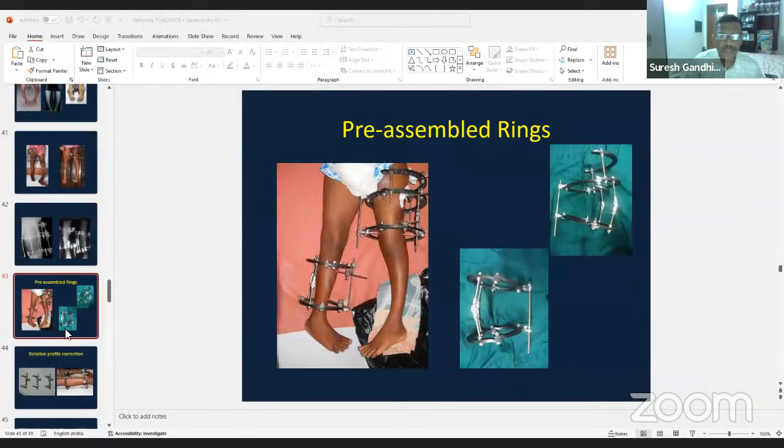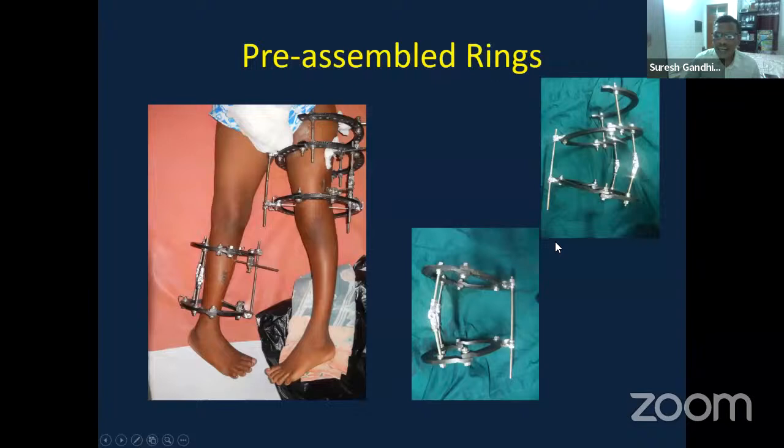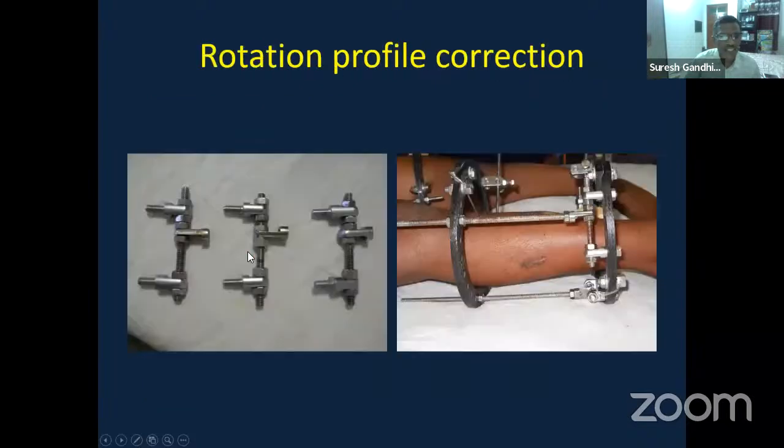Dr. Manoharan asked about the rotation correction and the first class of Dr. Govardhan sir. Actually, this is a patient having an internal rotation of the tibia. You can see here, and after the deformity correction, this is the construct. This was described, maybe I will discuss with Vasudevan sir at that time. I made it a 3 construct like this. The both will be this one construct.